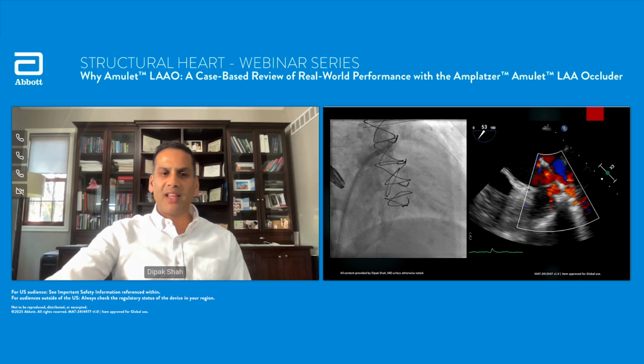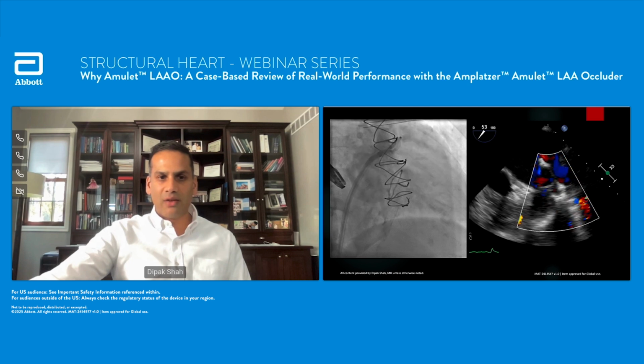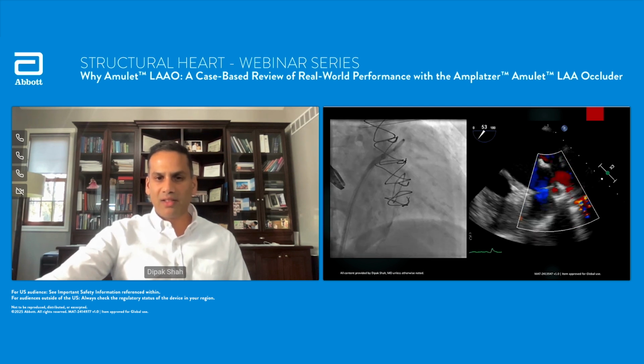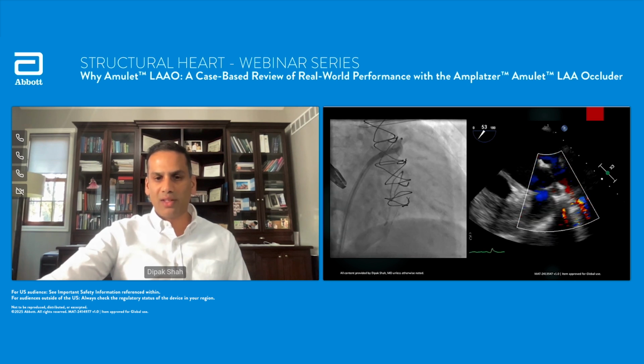So this is a case we had here, just playing this case here. You can see on the left the pigtail, and there's a little neck here, and then you can see flow into the appendage here. And you can see on this TE view here, again, you can see this little opening right on that bottom rear, right near the circumflex, where there's flow into the appendage.